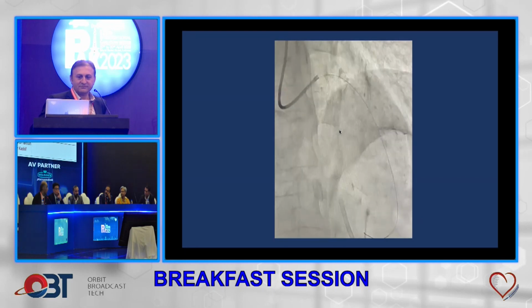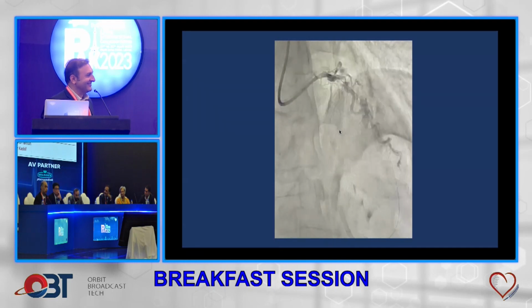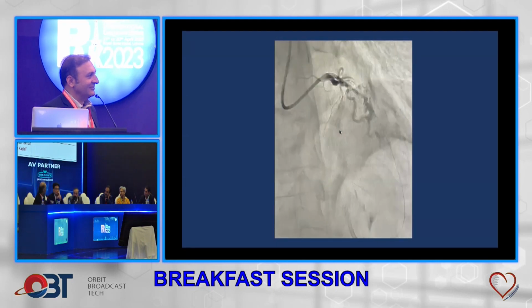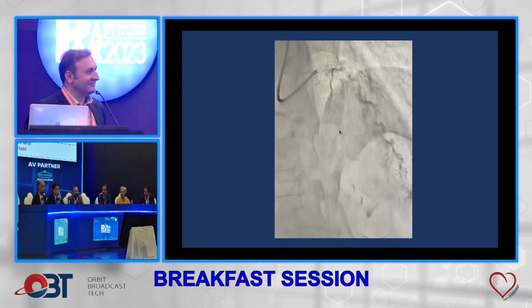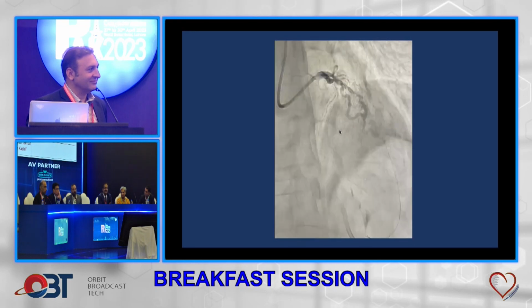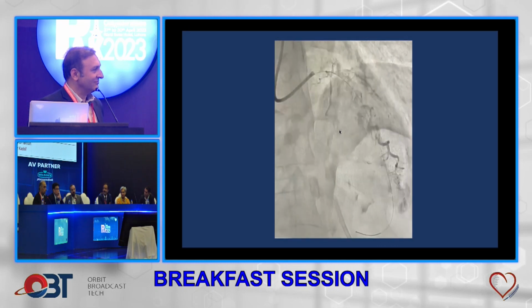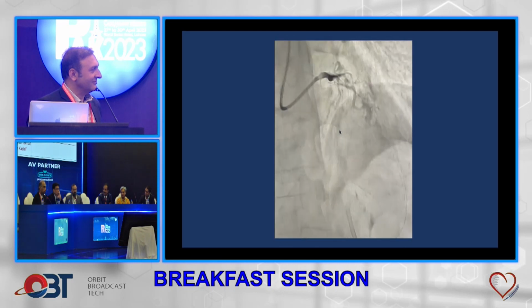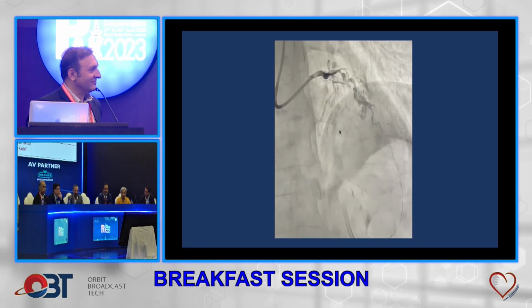So Bilal, what will you do at this time? When you cut off a difficult, extremely difficult situation, you may lose the patient if you don't control your nerves. But anyhow, when you don't have a surgical backup, you have to strive and save the patient, and again go and rewire and of course save the diagonal and LAD. I don't know where I'm going to wire and what I'm going to do.